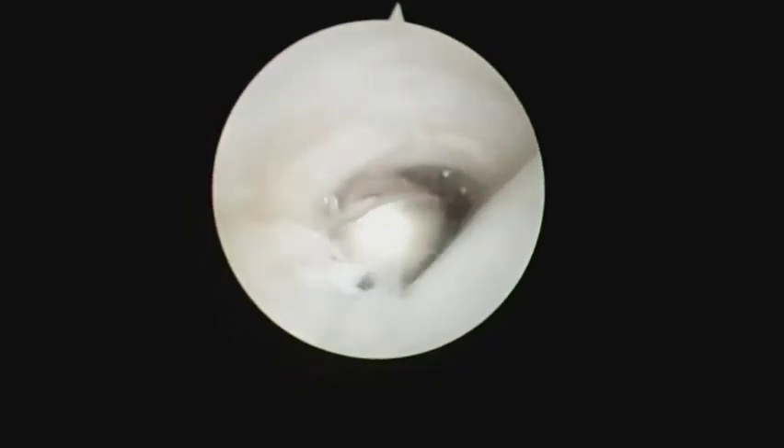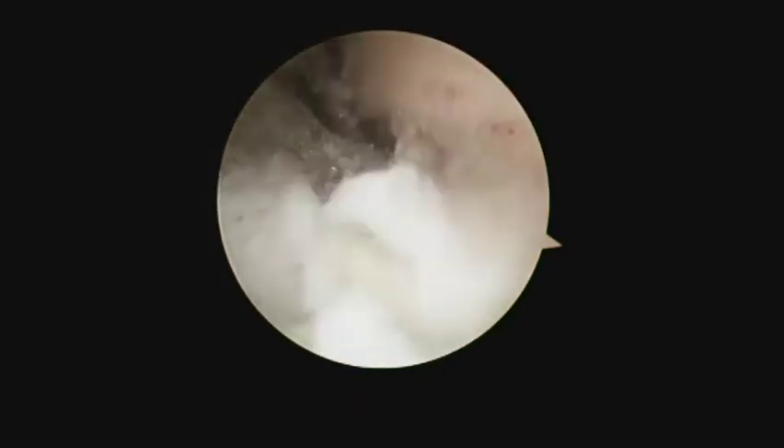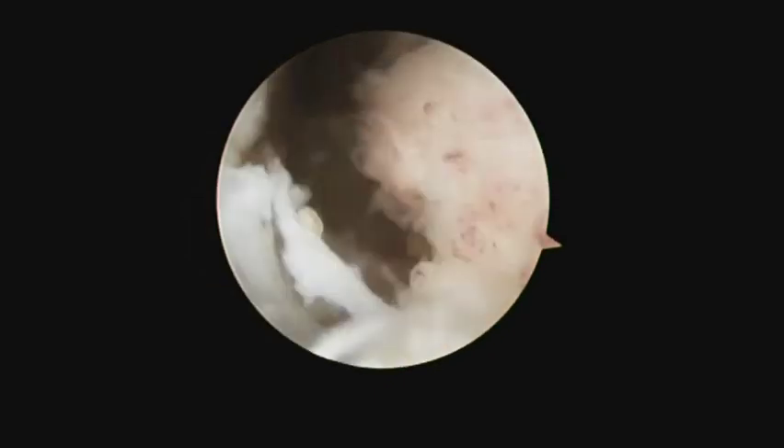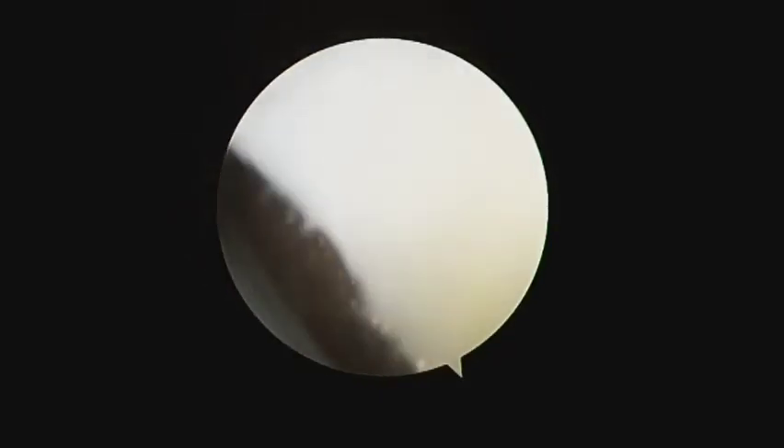Finally, the arthroscope is switched to the distal portal. Zone 1 peroneal tendoscopy is then performed. Zone 2 peroneal tendons and both the peroneus longus and peroneus brevis tendon are examined for any synovium. Any inflamed synovium over the tendons and the tendon sheath is then resected.